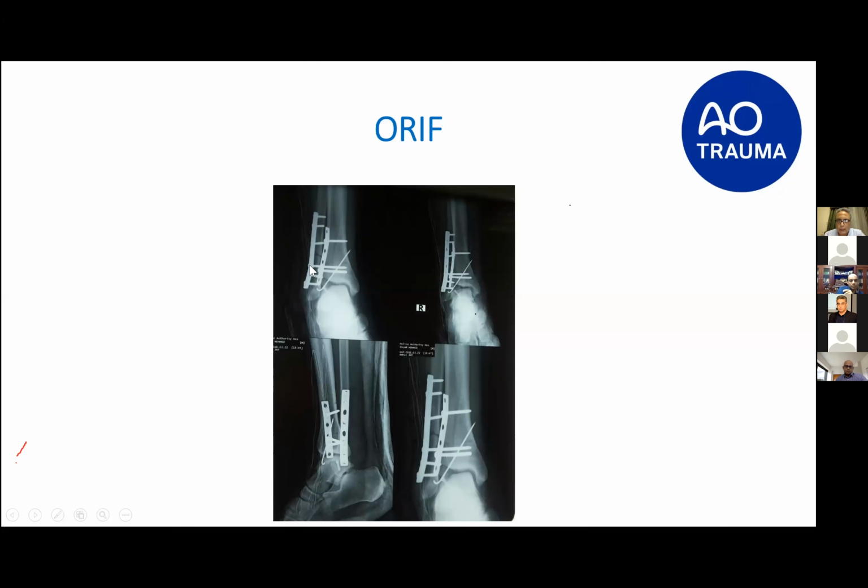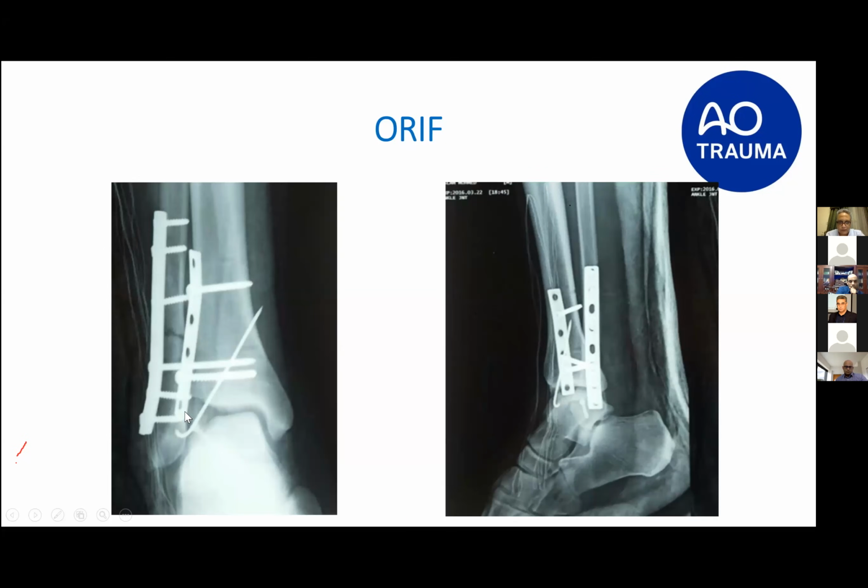Of course, we had a syndesmotic injury, so I did this. Once I did this, as you can see, the medial clear space has been reduced. So I think I was lucky enough that I did not have this medial clear space or incarceration of the deltoid ligament. This is the post-operative X-ray. You can see here one plate, just a one-third tubular, very simple. I put it here as a buttressing plate with just two screws only.